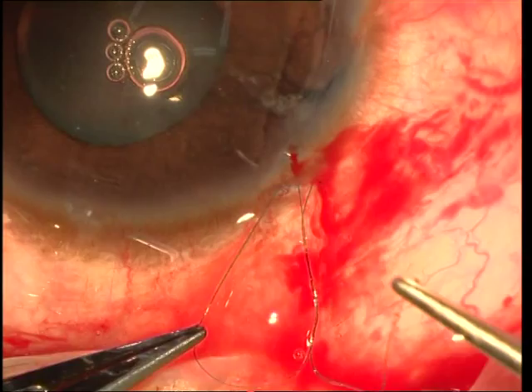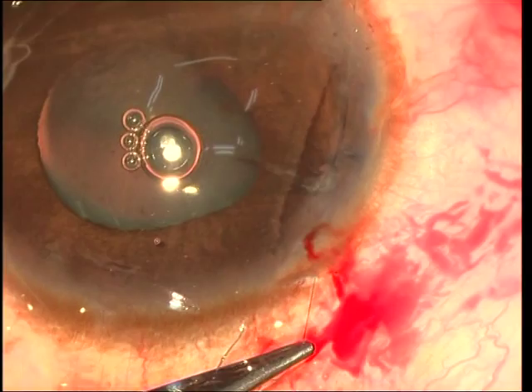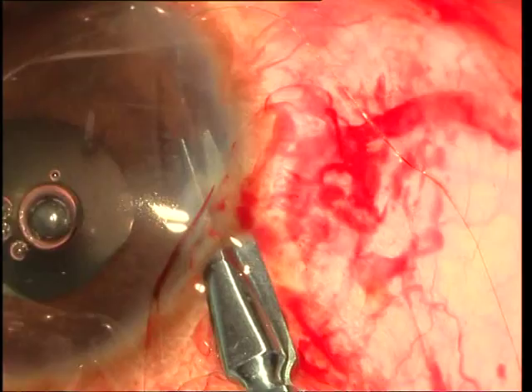Once it has been looped around three or four times, the suture ends are pulled on either side and this makes the knot move inwards, effectively suturing the two iris leaflets together. The knot can be secured more firmly by bringing out a loop once more and throwing a knot once again.